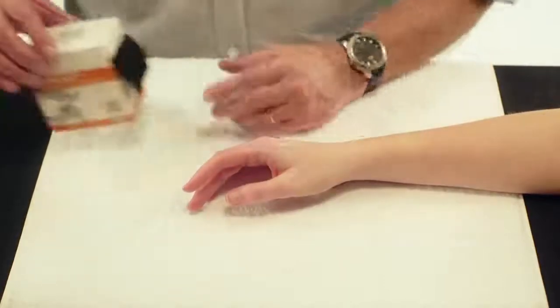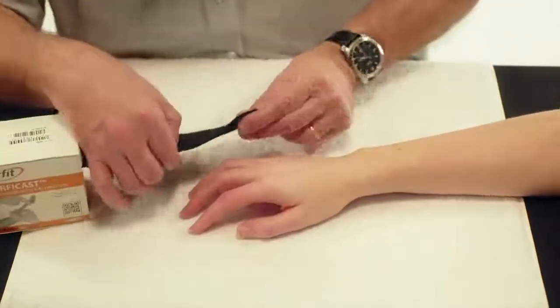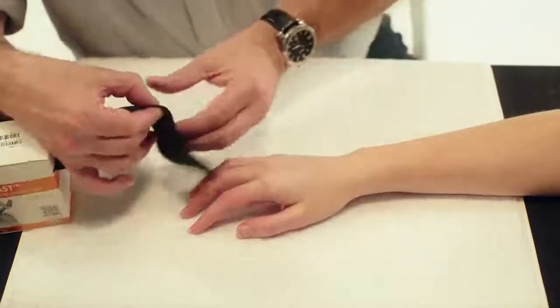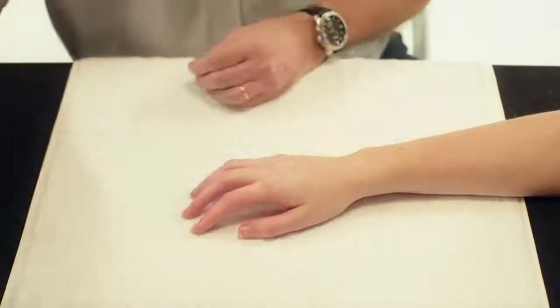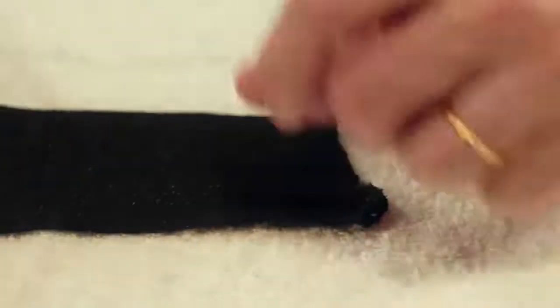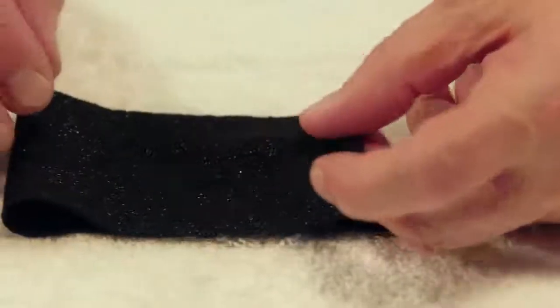Use a strip of six centimeters wide Orficast, twice the length of the finger. Fold the piece of Orficast in half.